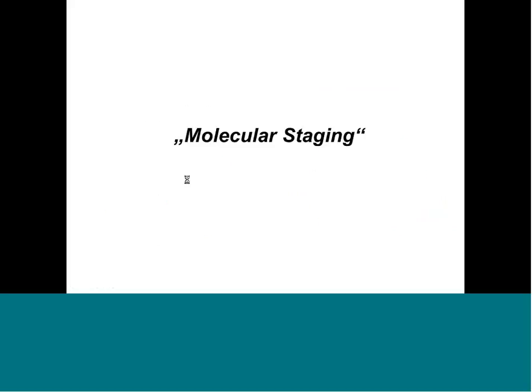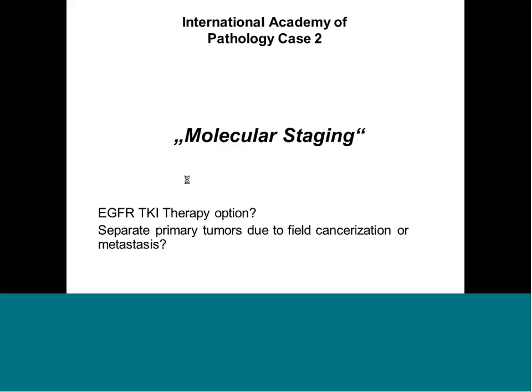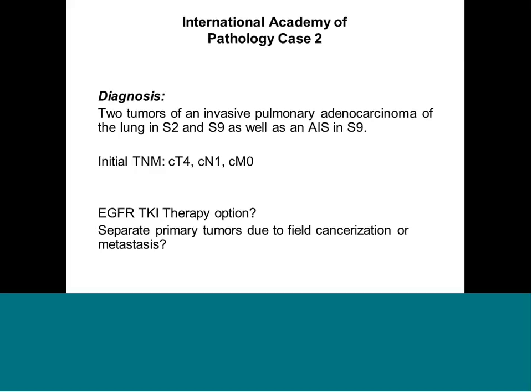Molecular staging. It's a big question if you have patients with multiple tumors, what is the metastasis and what is the second tumor, because that heavily influences clinical decisions. And I show you just briefly 2 cases I teach for the International Academy of Pathology. Here we had 2 tumors of an invasive pulmonary adenocarcinomas in segment 2 and 9. And the question was, is this a primary and a metastasis?